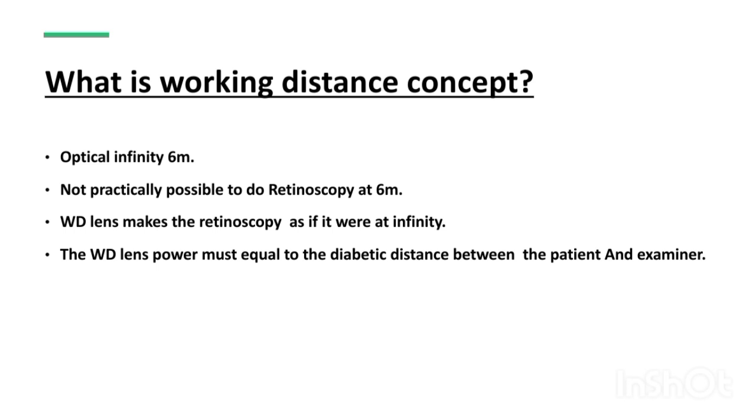So if we are doing the retinoscopy not from infinity, then the light which we are using to obtain the refractive power of the patient's eye is also not parallel rays. Okay, so that is actually diverging rays, because the source of the light rays is from near, so that will be diverging rays.